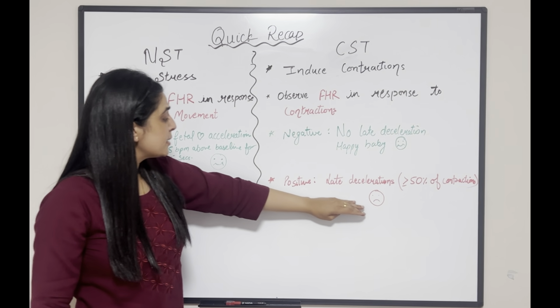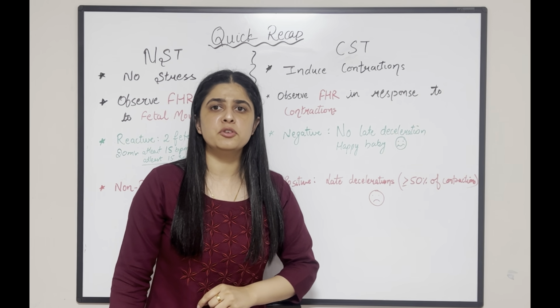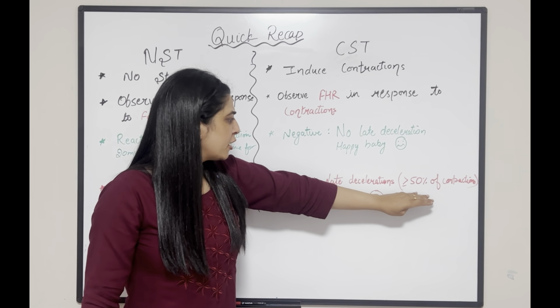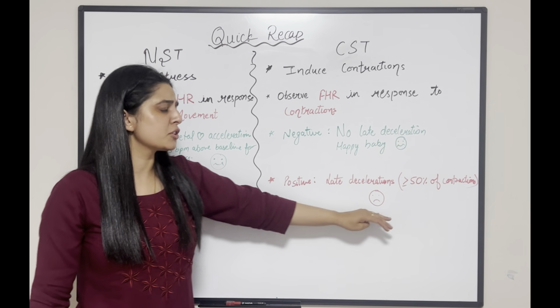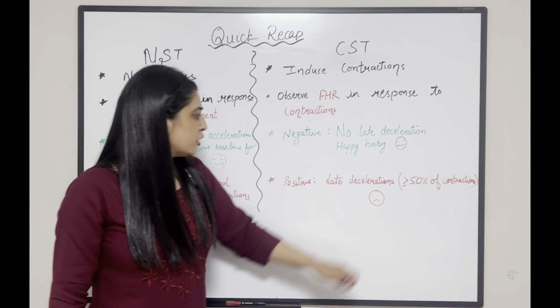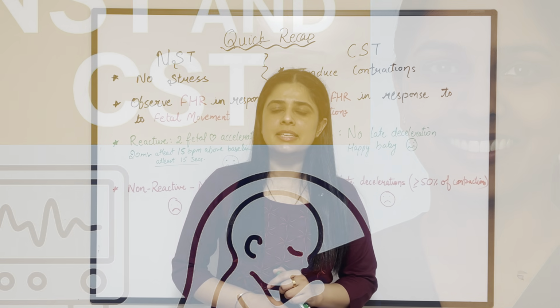But if CST is positive, that means your fetus is under some stress. You have to do something to save the fetus. Late decelerations in more than 50% of contractions mean your baby is under some stress, and you have to do something to save the baby. So this is all about today's topic, NST and CST.